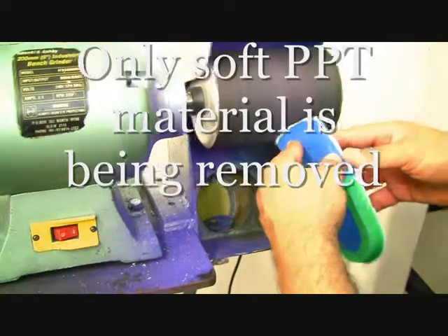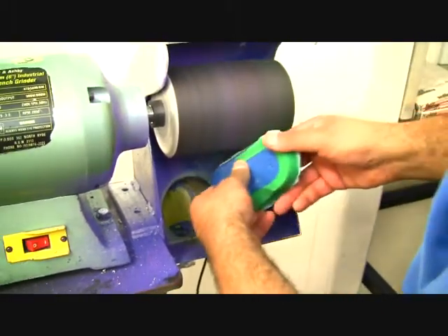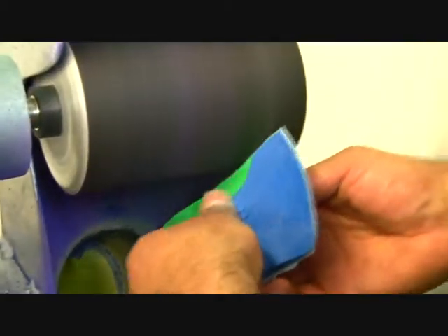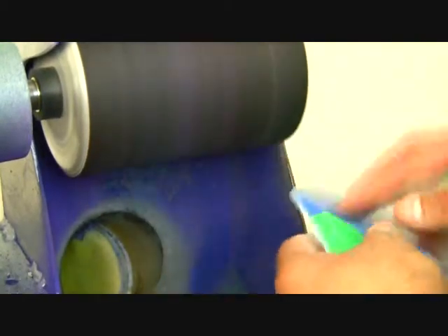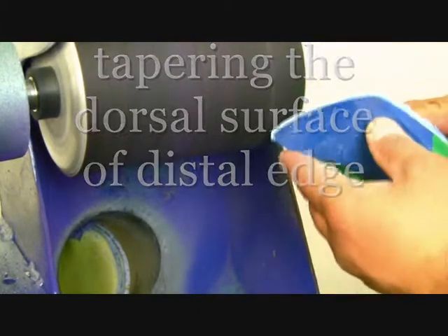The purpose of this exercise now is to remove the PPT material without destroying or removing any of the EVA material, and note the technician is paying particular attention to the angles on the medial lateral sides and also around the heel cup area.